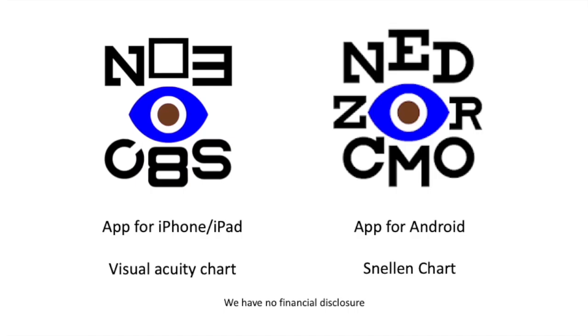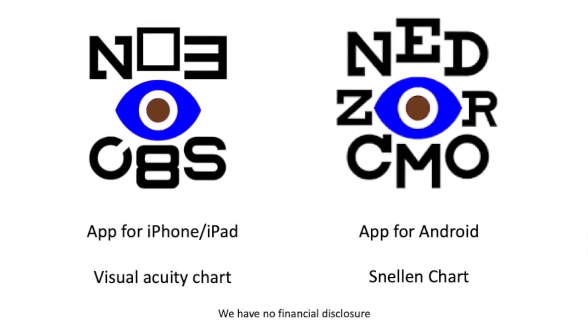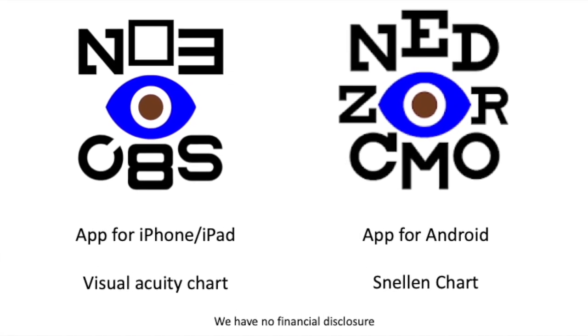Thank you for listening. Hi, I'm Kajal, one of the orthoptists working here at the Department of Ophthalmology. Normally myself or one of the techs checks the visual acuity in the clinic, but I'm going to show you how to download the app so that you can test the vision at home on both Android and iPhone. Although we have no financial disclosures, we have used Visual Acuity Chart for iPhone and Snellen Chart for Android.